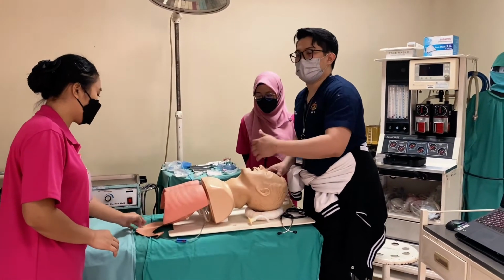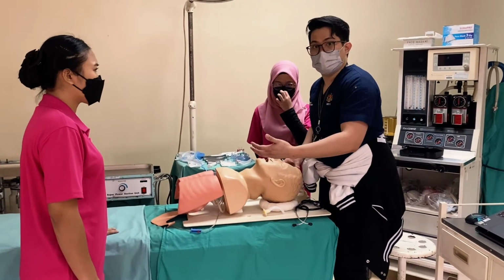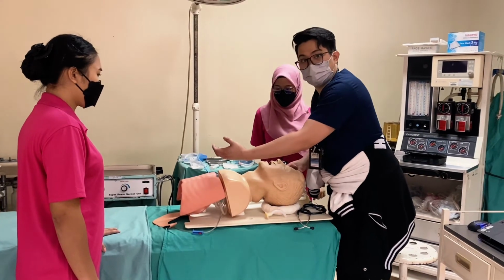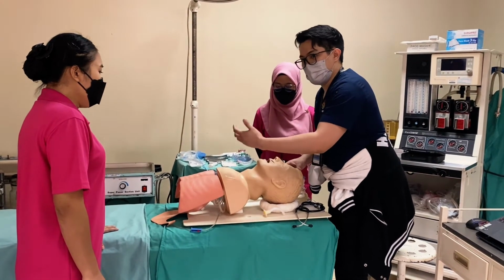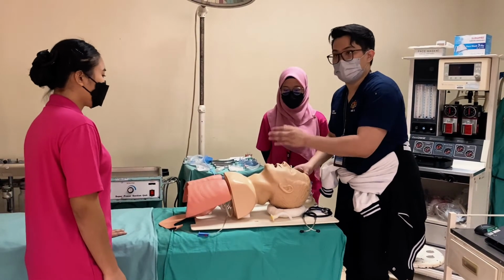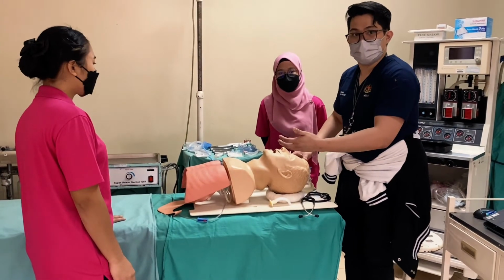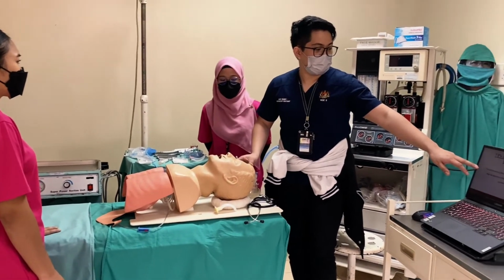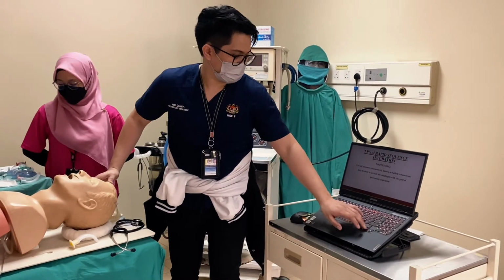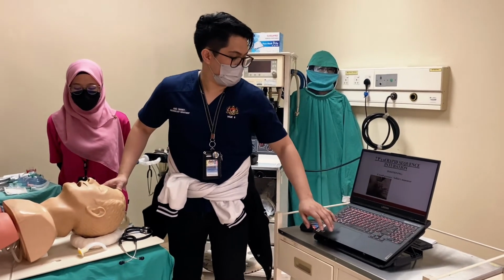For a patient whose last meal we don't know about, sometimes food or any food substance will come out of the mouth projectile due to us giving the muscle relaxant. That is why we are required to do this Sellick maneuver to prevent aspiration. This is one example of the positioning that we do.